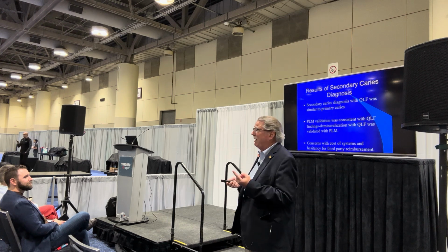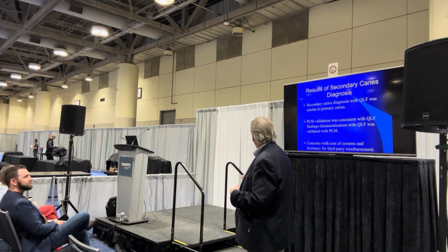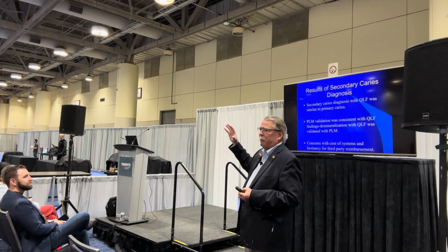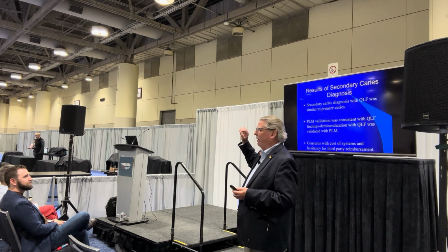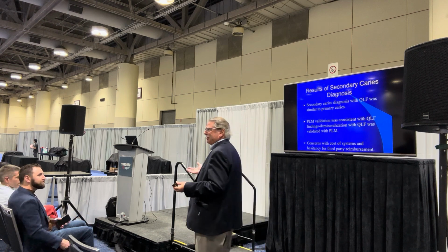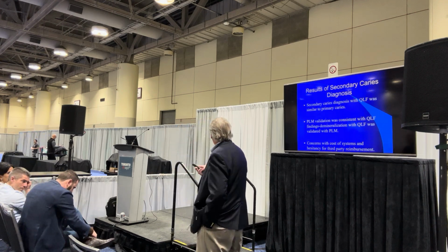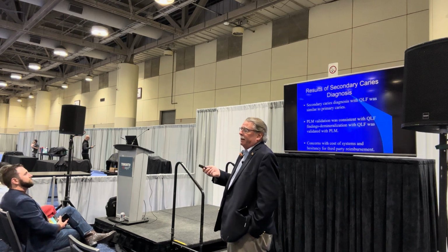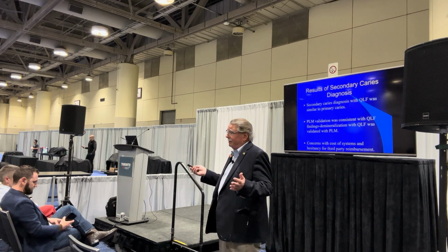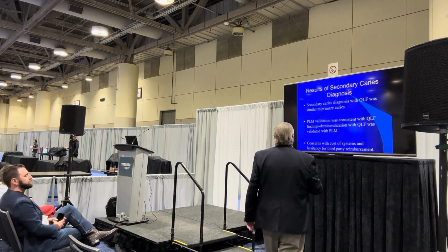Well, number one, the head was kind of big, very cumbersome on little kids. Teenagers, great. Little kids, a little tougher. Next, the cost. The biggest one was cost. So by the secondary caries one, we went to a newer unit, which went from, you know, $85,000 down to $15,000. You guys going to go buy one for every op for $15,000? I mean, it's impractical, totally impractical. So, you know, by now, obviously, it would be much lower and it'd be effective, but nobody wanted to progress with it because insurance wouldn't pay for it. And, I mean, you got to get paid for what you do, especially if you're paying $15,000 for a piece of equipment.